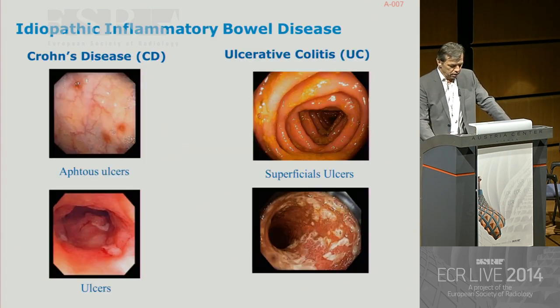Very quickly, are we able to differentiate Crohn's disease from ulcerative colitis? Generally, we are not asked to do that, because it is not always the case, and we have a lot of non-characterized colitis. I'm going to show you some possibilities to try to differentiate the two entities.